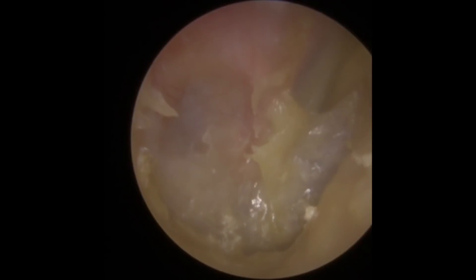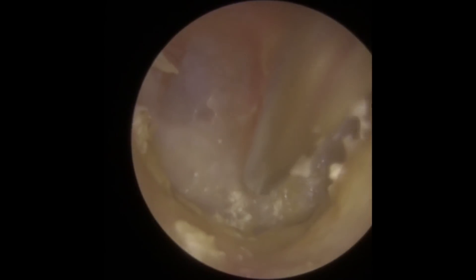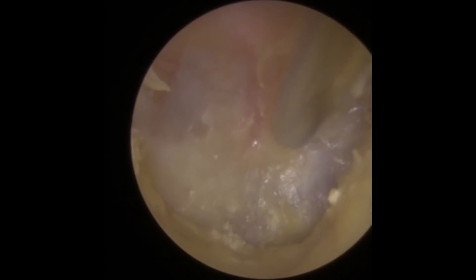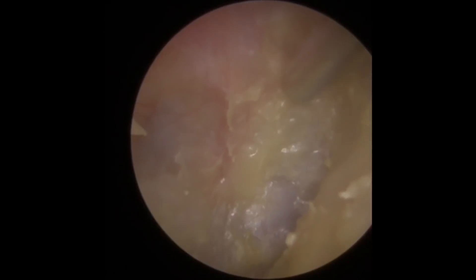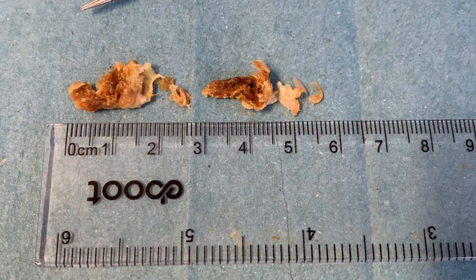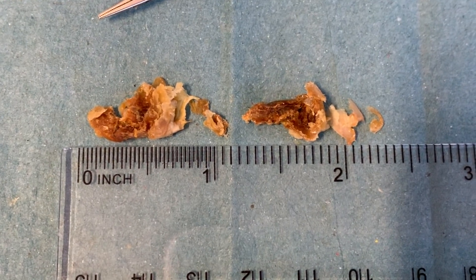I'm going to have to try and clear some of this off the drum. The gentleman was an absolute star — he tried to stay as still as he possibly could so I could get this off for him. You can see it's just very liquid material now, not that hardened material I was expecting. He's staying really still, so we've managed to get a lot of this off the drum. I'm not going to get it completely clear today, but you can see the material we removed — this very hardened wax with the whiter dead skin underneath.